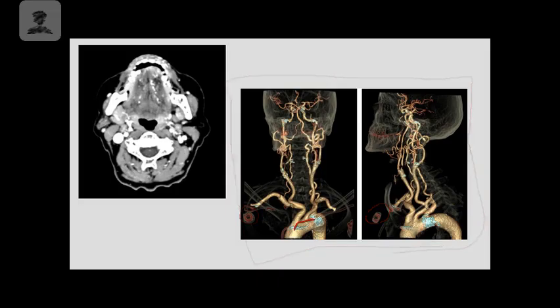You can see the aortic arch here. You'll be able to watch as they extend off and go up into the carotid arteries, and then you're going to have the internal carotids that come up into your circle of Willis. So we can choose to do that. The 3D reformats are honestly really cool to work with.